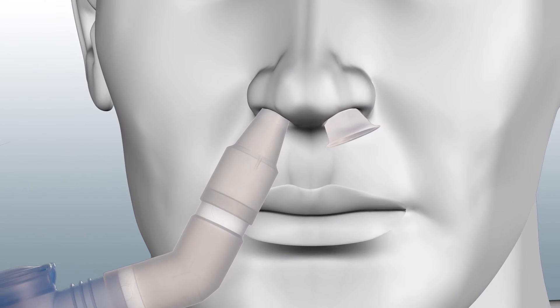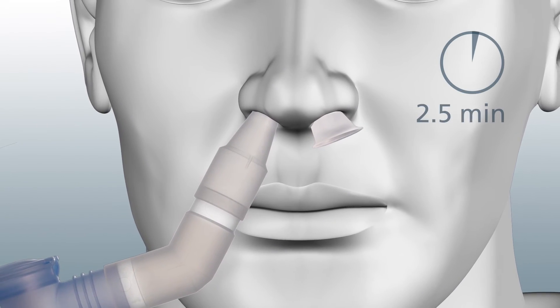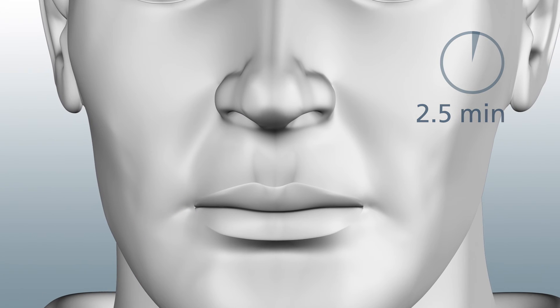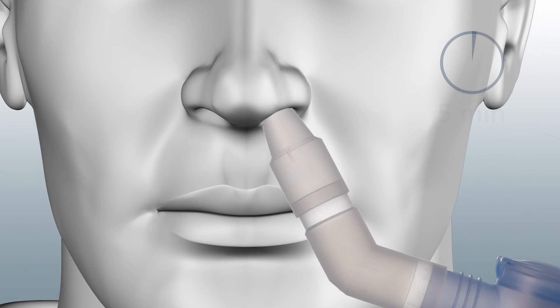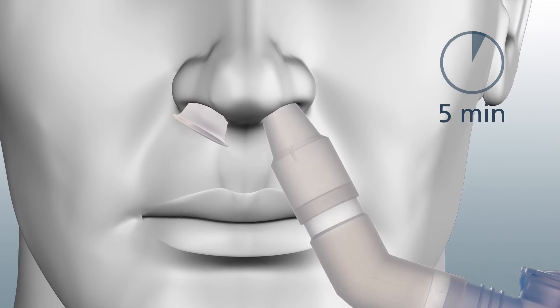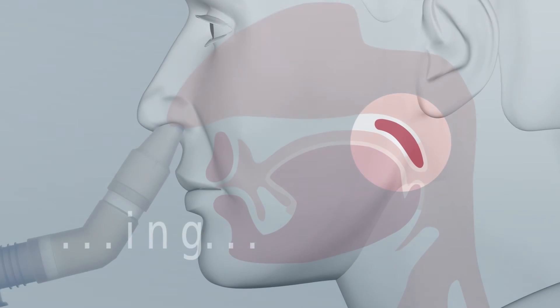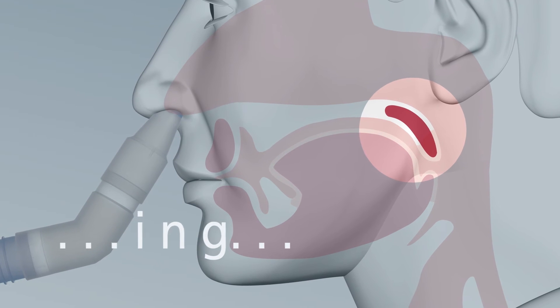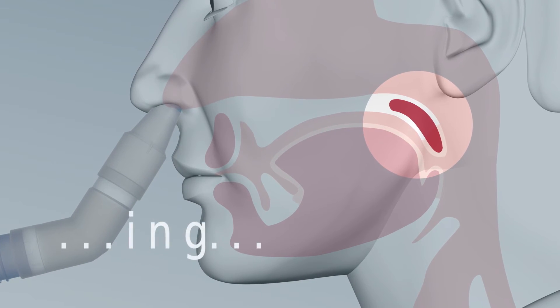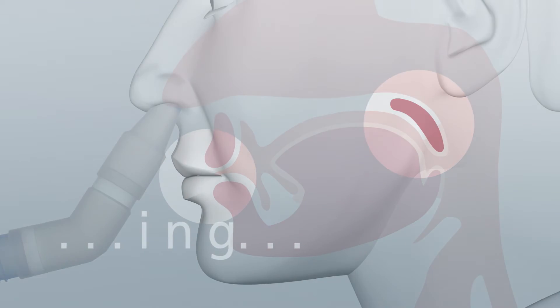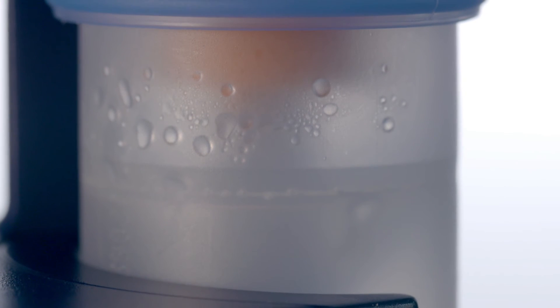After two and a half minutes, the nebulizer and nasal plugs should be swapped over and the treatment continued until a total of five minutes have passed. If you are saying 'thing' to close your soft palate, continue doing so after each break until the treatment session has been finished.